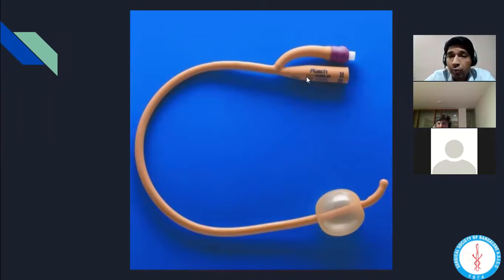The full name is Foley's two-way self-retaining balloon catheter. So you have two channels, one channel to inflate the balloon where you inflate distilled water, and the other channel is for aspirating the contents. Similarly, you can even have a three-way tube where one can help in irrigation and the other channel will act as aspiration apart from the one for the balloon.